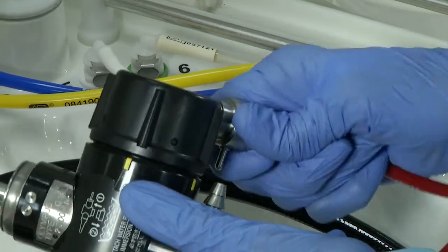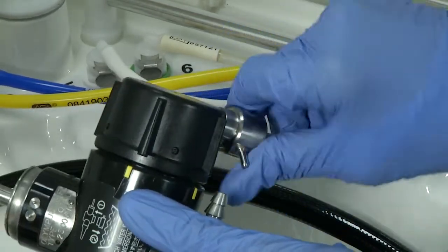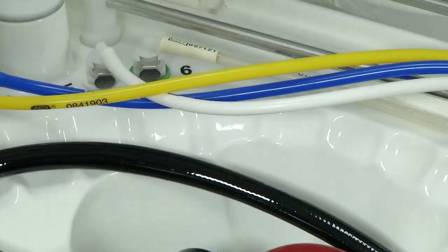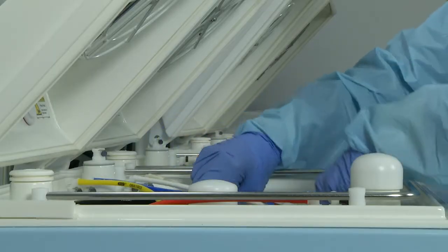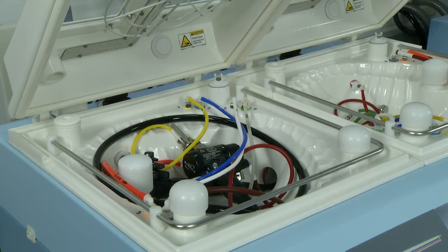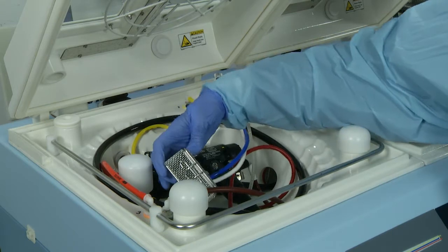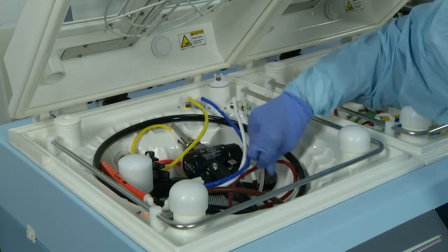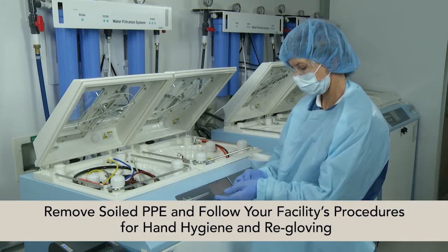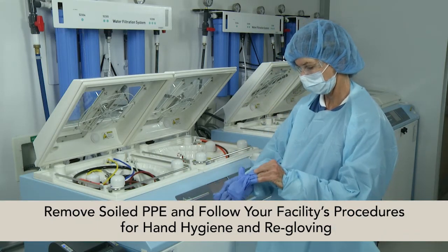Check to ensure the connectors are placed in a way that will prevent them from being caught in the spray arm when the lid is closed for processing. The connectors should be lower than the metal bar that encircles the basin. Place any small scope accessories, such as the water suction buttons, in the metal mesh basket and place it in the basin. After proper placement of the scope and connectors, remove contaminated gloves.